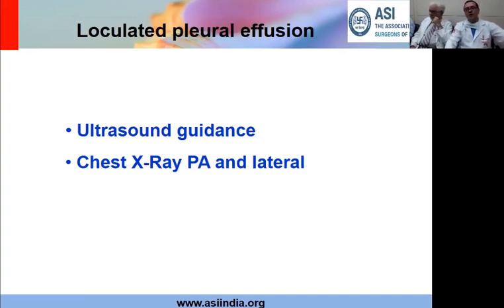You take the patient to a radiology suite, ask them to do an ultrasound, tell them to give the best accessible window, try and aspirate there with a needle or Venflon, and mark the site. Okay, this is the site. You can bring the patient back to your ward or OT and put the chest tube there.